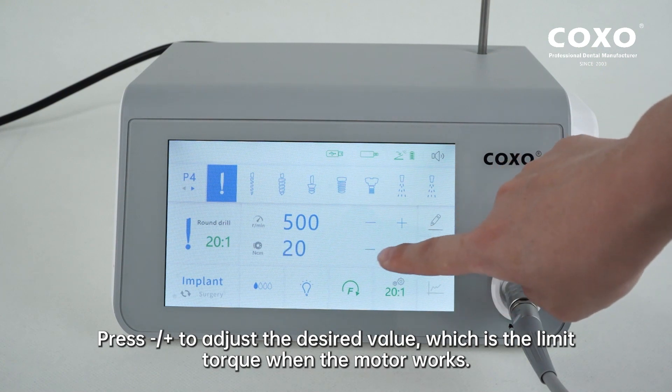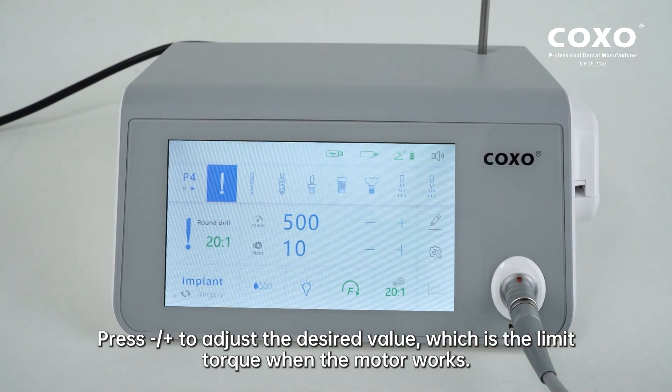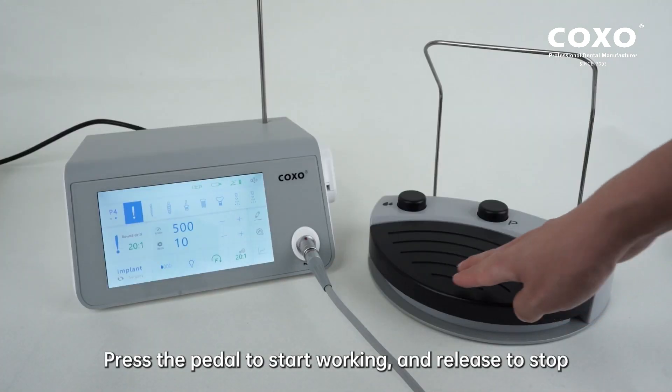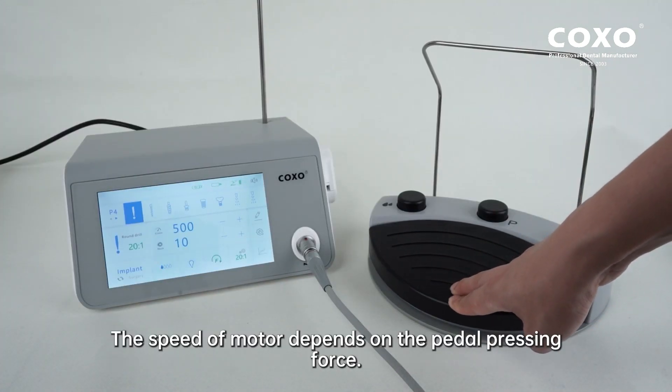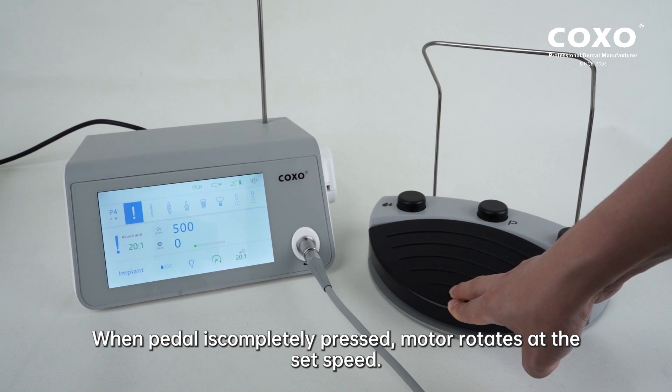Press minus/plus to adjust the desired value, which is the limit torque when the motor works. Press the pedal to start working and release to stop. The speed of the motor depends on the pedal pressing force. When the pedal is completely pressed, the motor rotates at the set speed.